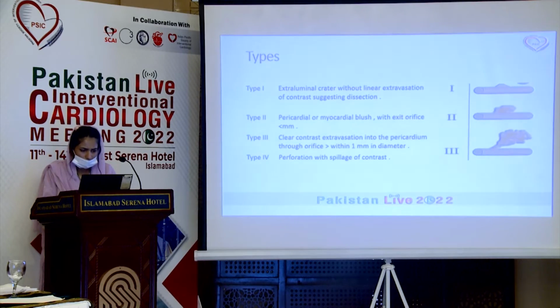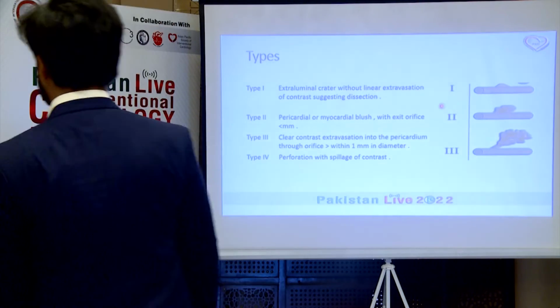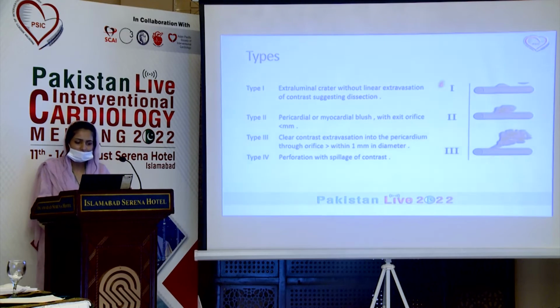Laser pointer. Okay. There are different types of perforation. Type 1 is extraluminal crater without linear extravasation, type 2 is pericardial or myocardial blush, type 3 is clear contrast extravasation into the pericardium, and type 4 is perforation with spillage of contrast.